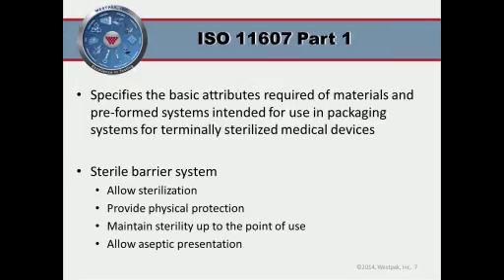The sterilization techniques used in the medical device business largely dictate the performance characteristics of the package system itself, namely a barrier through which a gas can pass, but microbes and viruses and similar things cannot. We've been awaiting news of new sterilization techniques for years, decades perhaps, or longer, but we're still stuck with ethylene oxide gas as the primary method of medical device sterilization. Until things like antimicrobial films are perfected, we'll be basically stuck using this spun bond polyolefin, which is the generic name for what most of us recognize as Tyvek. Tyvek is the trade name used by the manufacturer of that particular material.